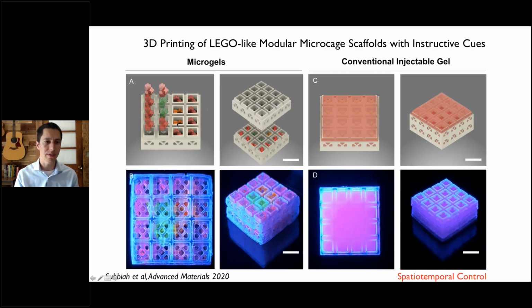So here we compare essentially microparticles that are distributed in a specific format across this 3D printed structure after stacking with your conventional composite scaffold material. So this is essentially the same 3D printed beta-TCP material, but just completely covered with a type of hydrogel. And the idea here is to achieve the spatial temporal control over the biologic process that would happen after implantation.